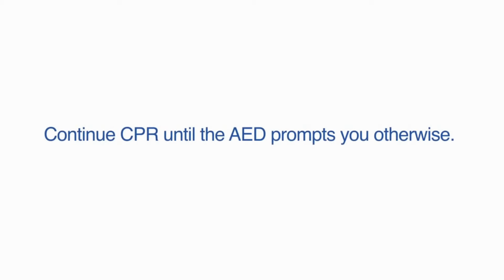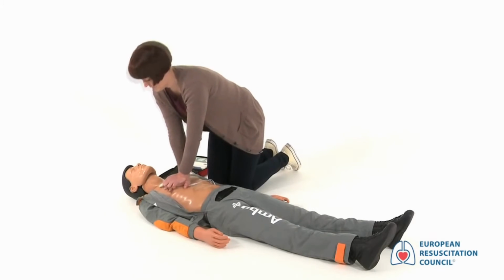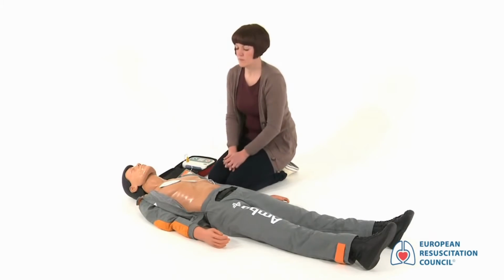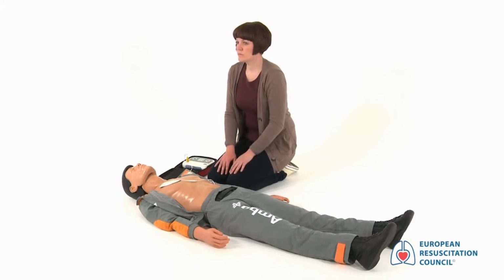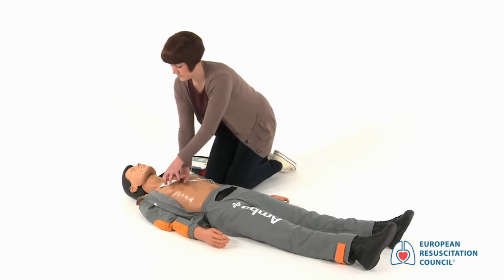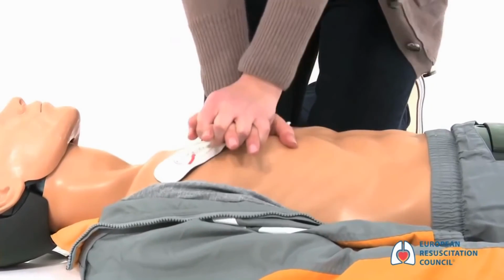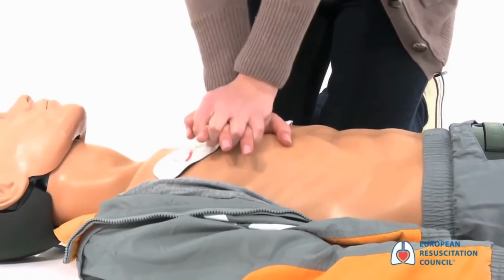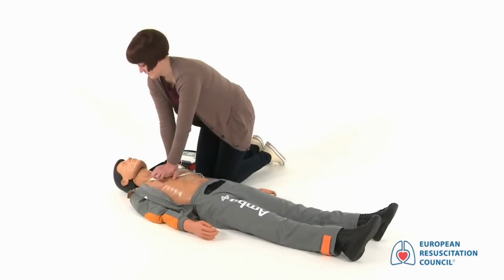When prompted by the AED, stop CPR and look to see that everyone is clear and call "Stand clear." Analyzing heart rhythm. Do not touch the patient. Stand clear. No shock advised. If needed, begin CPR. If the AED prompts "No shock advised," start CPR again as soon as prompted by the AED, continuing until prompted by the AED.